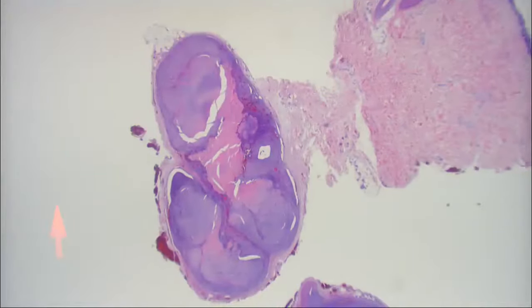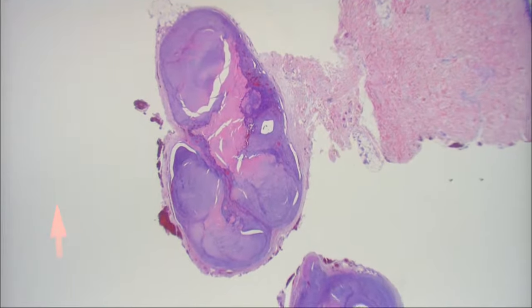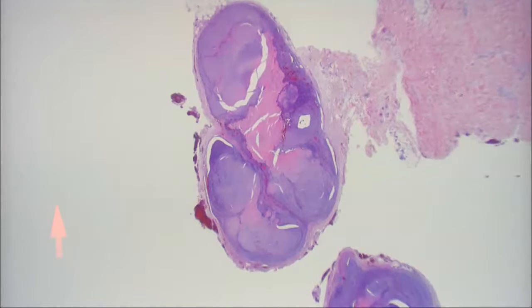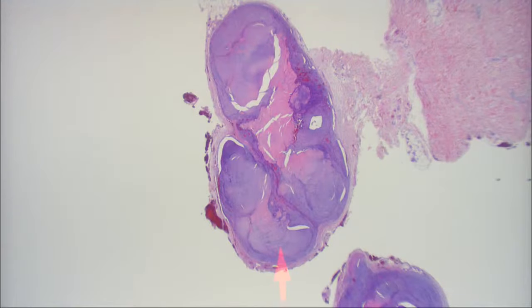So this is a deep punch biopsy. And there is a structure deep in the dermis. It looks cyst-like, and there seems to be a true lining. It's got a lot of other stuff. It's got some clefts in here too, right? It does. So there are alterations in the different types of cells within the structure. When I looked a little closer, I thought some of them almost had a ghost-like appearance, but I didn't see any calcium or deposits or anything like that. So you think this is a neoplasm? Yes. Okay, benign or malignant?